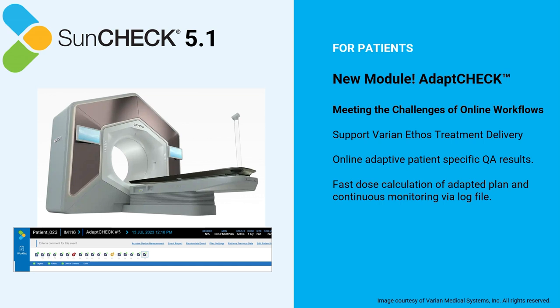I am now going to talk to you about AdaptCHECK. AdaptCHECK was introduced in SunCheck 5.1 and it was our first step into adaptive radiotherapy QA. It essentially allows SunCheck patients to plug into the Ethos treatment delivery unit. This allows us to support not just the initial plan, but the scheduled and the adapted plans for secondary dose calculation, as well as pre-treatment and in vivo QA.